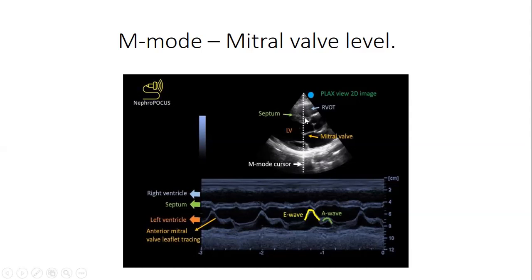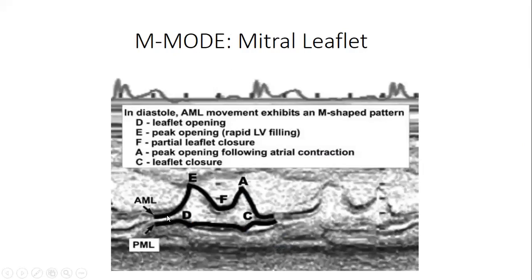And when you see amyloidosis, you are likely to see restrictive filling of the left ventricle. How will it affect the diastolic function? It won't stretch. If you've been having myocardial infarction and all those things, they will still affect the compliance of this. So that is how you explain this part.